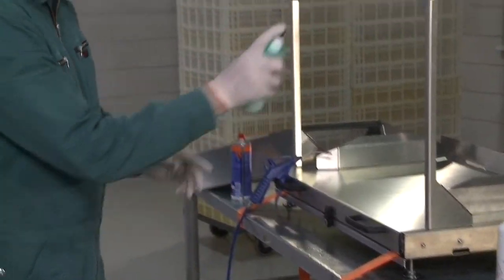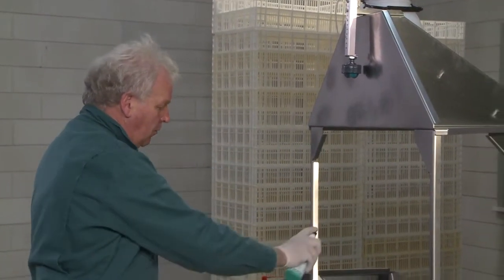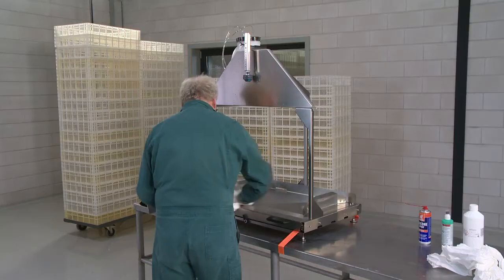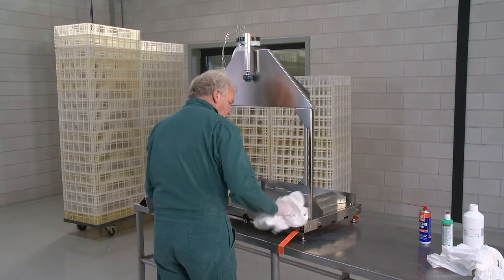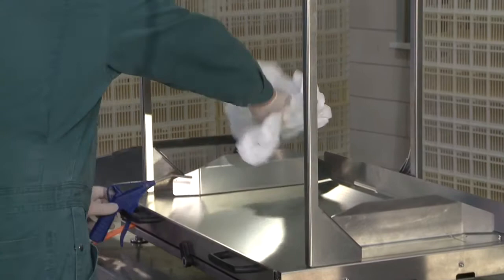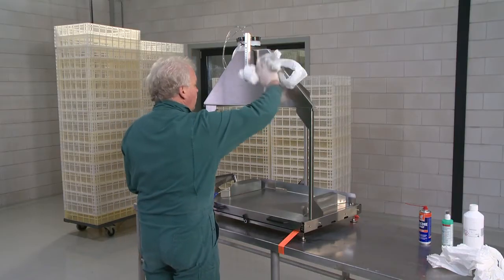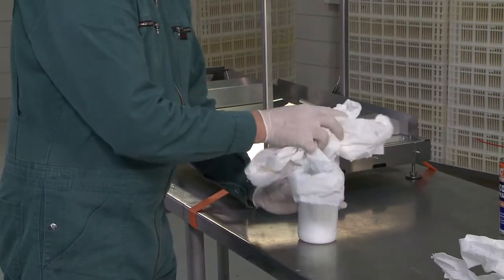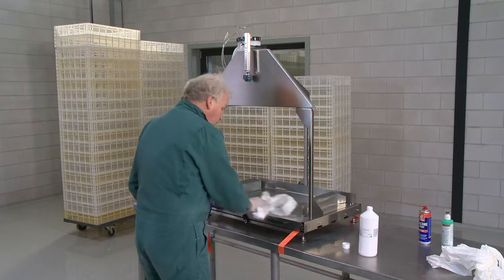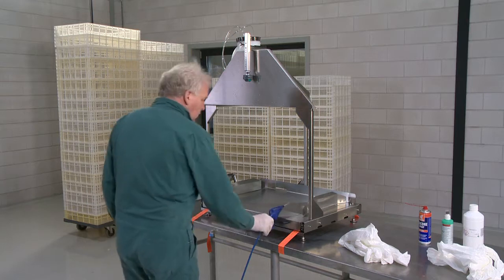The Nobilis spray can be cleaned with a solution of mild detergent in clean demineralized water to rinse the whole device. It is also possible to use a pressure washer at a minimum distance of 1 meter, 40 inches, to clean the device. Using a pressure washer closer to the device can damage or break it. In addition, it is recommended that the outside of the device be disinfected after every vaccination session using 70% isopropanol or commercial disinfectants at recommended concentrations.